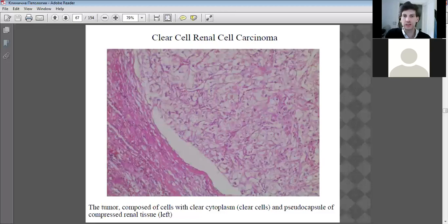The cancerous cell doesn't do that as such. It rather divides its mass and obtains its nutrients from surrounding tissue. The fibers here are very, very well developed, strand-like, and supported by dividing tissue or nuclei that are adding protein to the fibrous mass. This space here is a fluid-filled space in between the fibers and the tumor.